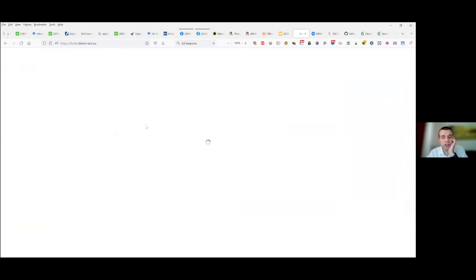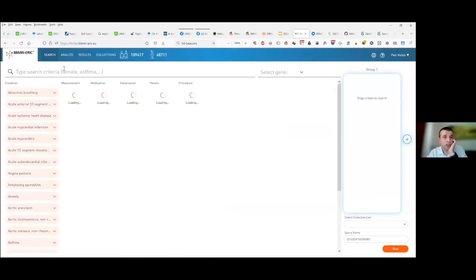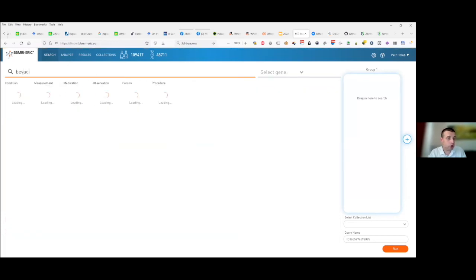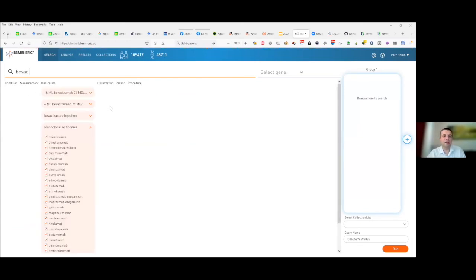This is the Finder tool that is part of the federated platform. If I start searching for patients here in their statistics, this is basically doing privacy-preserving federated querying. So no personal data is shared. It's not centralized anywhere as a platform as such. Of course, the CRC cohort in particular has been already pre-centralized, but this works on distributed data sources by default, and you can search consistently across centralized as well as federated data sources, and you can search on basically any OMOP artifacts in here.